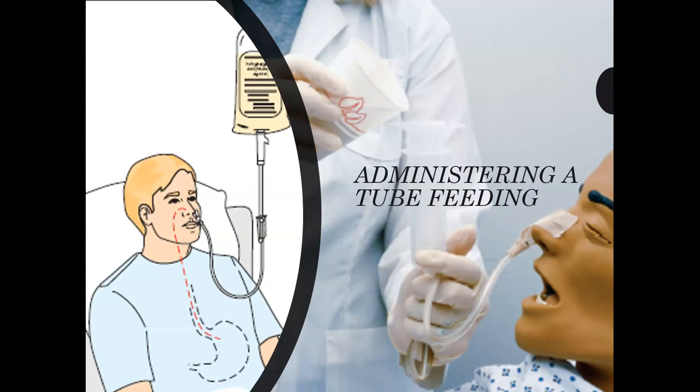This is how they get their nutrition. So you'll probably see these a lot more in the ICU, but could definitely see them anywhere. These same concepts, for the most part, would apply to giving medications or feedings through a PEG tube as well. So just keep that in mind.